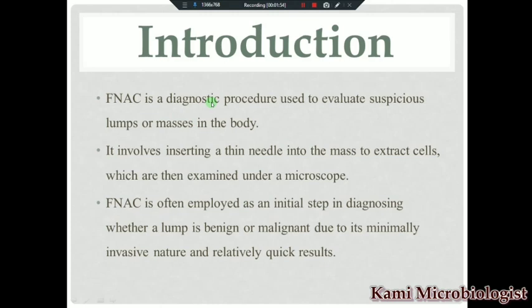We insert the needle at that particular area where there is a lump, mass, extra growth or swelling, and take the fluid or tissue, for example cells. Then we make a smear on the slide, fix the cells, and examine the slide under the microscope.